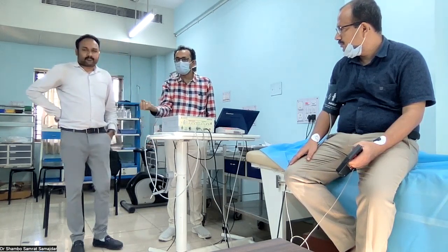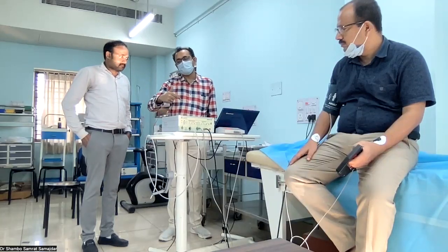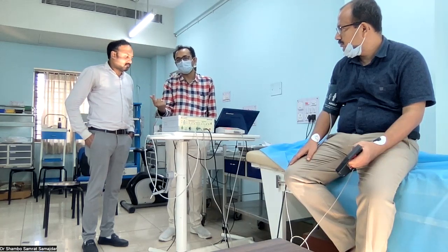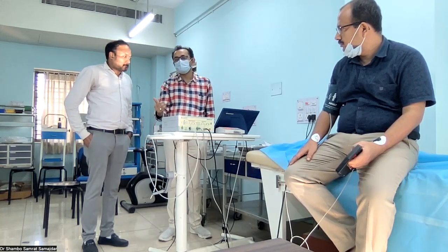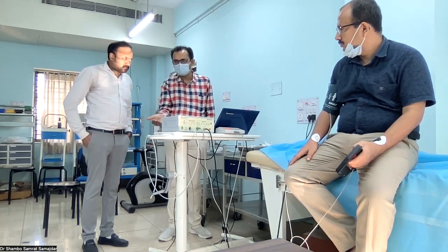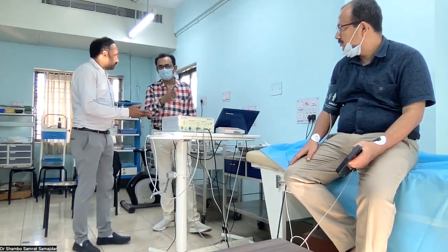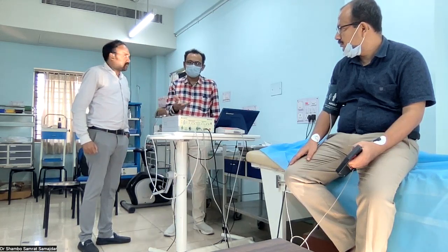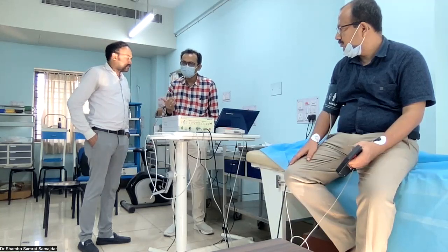But after that holding of the hand grip at 30% of the maximum pressure, we can calculate the change in the diastolic blood pressure. If the diastolic blood pressure rises by more than 16, then it's normal. So let's do this test. According to this machine, we need to modify that protocol a little, and what we are referring to is known as Ewing's protocol.